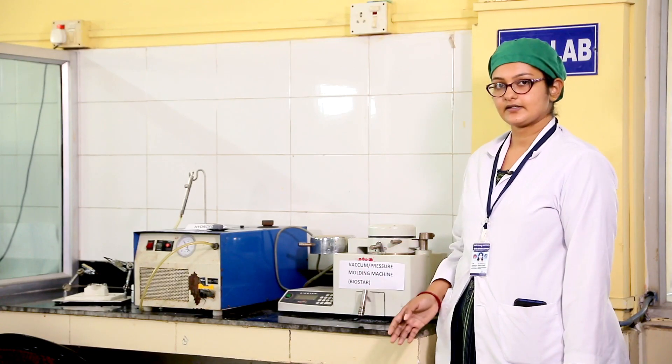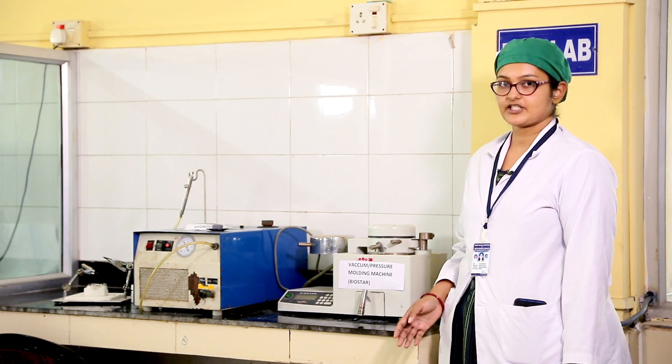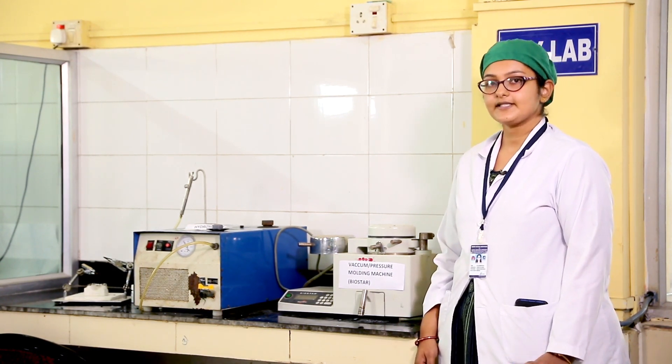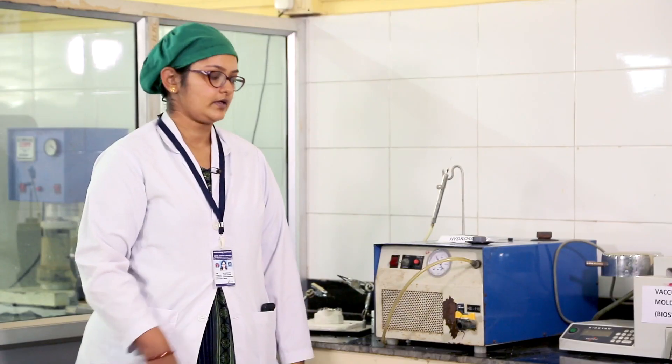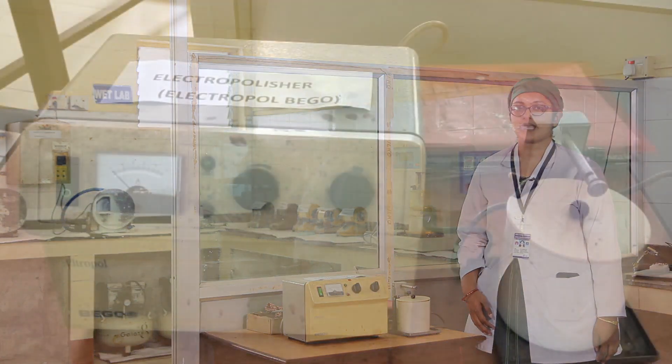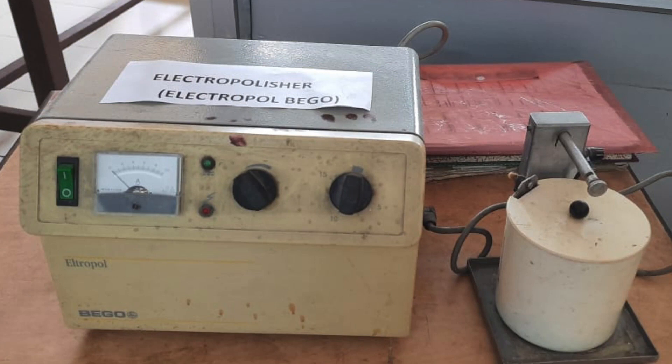Now coming to the dry part of our lab, where we have highly equipped advanced instruments. This equipment is a vacuum or pressure molding machine, where we make plastic retainers for the patient. This is a hydrosolder, where orthodontic appliances are joined using solder metal. This is an electro polisher — after soldering of the orthodontic appliance, we polish the appliance here using an electrolyte film.